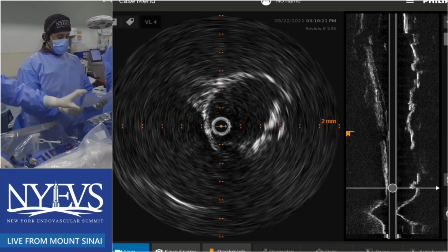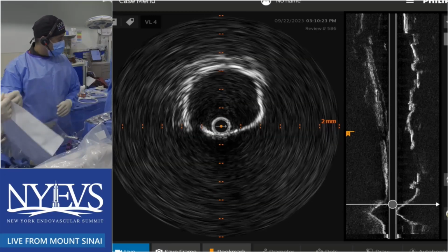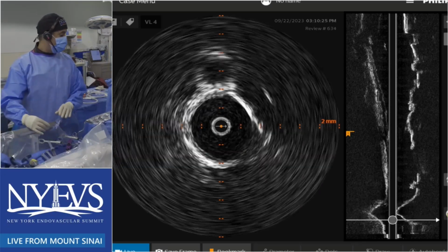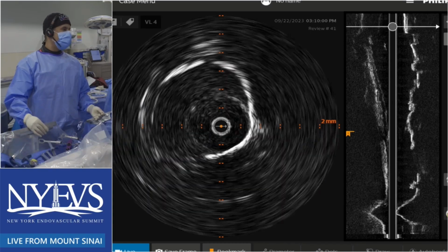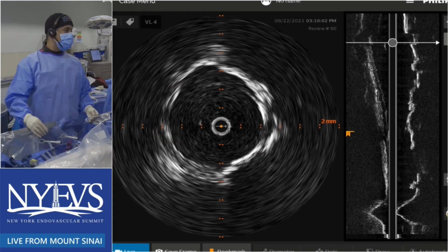So I think you need a balloon expandable stent here, whether it's covered or bare metal probably doesn't matter that much in the end for this particular lesion. But I think balloon expandable is the way to go. Self-expanding is not going to work with the eccentric lesion.